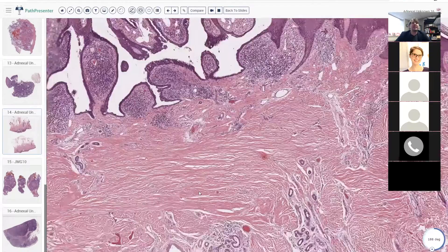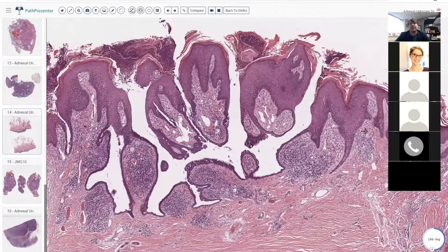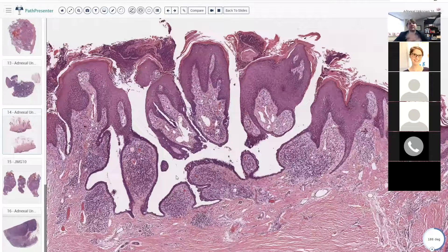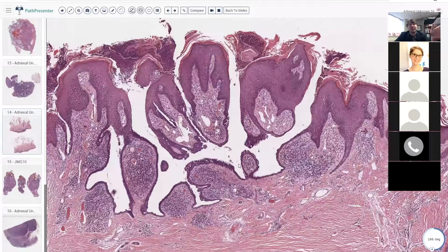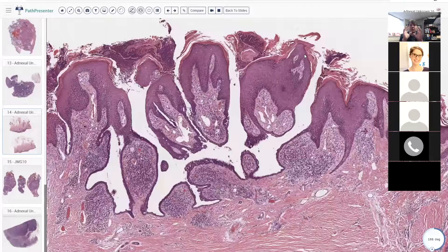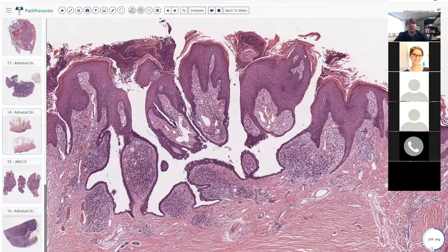I've got a whole video about nevus sebaceous you can go nerd out over, but here what we're going to talk about is this lesion, which often arises in the setting of nevus sebaceous. This is an example of syringocystadenoma papilliferum — that's why we call it SCAP, because it's a ridiculously long name. What you have is cystic spaces with papillae — similar in a way to digital papillary adenocarcinoma — but the big difference here is number one, this lesion essentially always arises from the epidermis and grows down, whereas digital papillary adenocarcinoma, to my recollection, is always dermal or subcutis-based, separate from the epidermis.